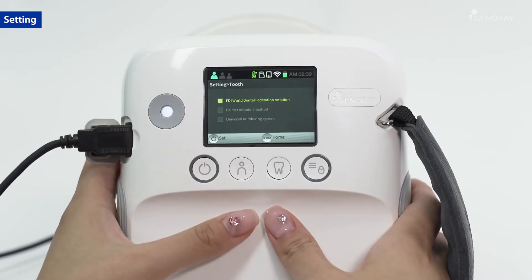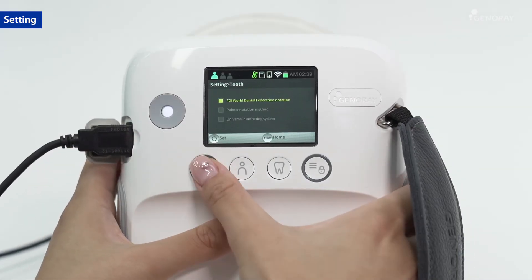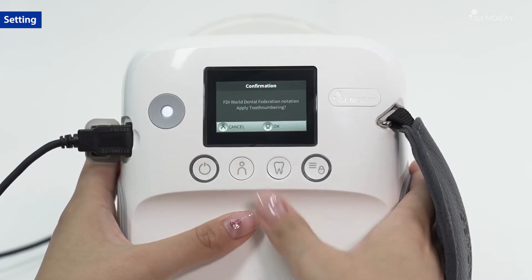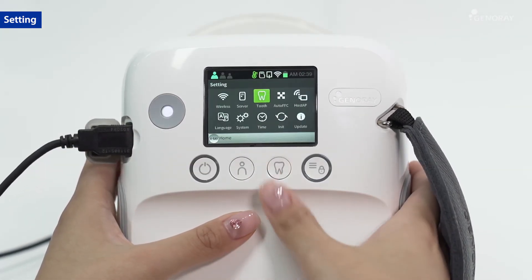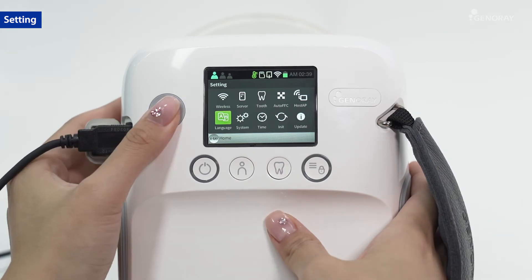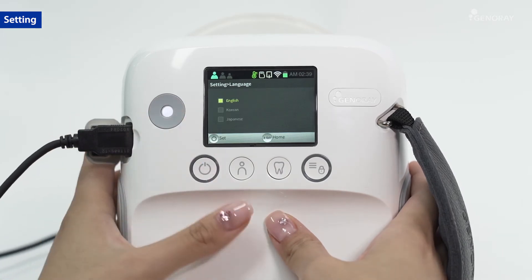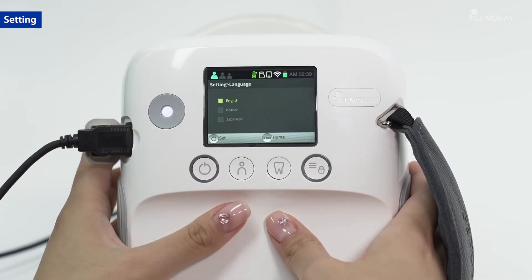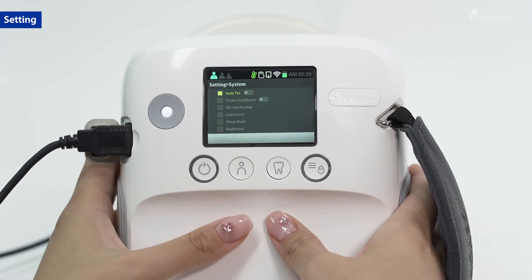You can choose your preferred tooth numbering system. Language can be set to English, Korean, and Japanese. Set up other system options as needed.